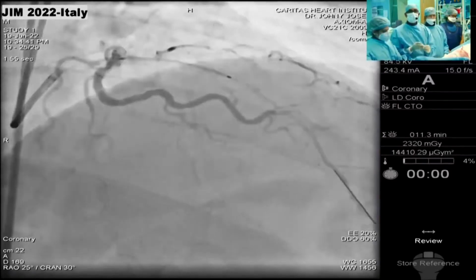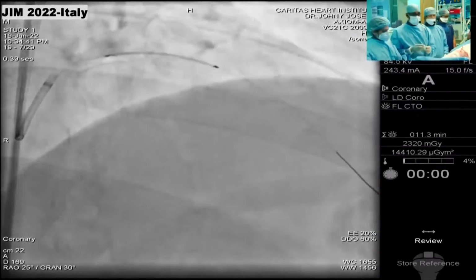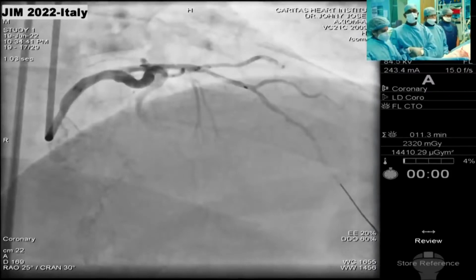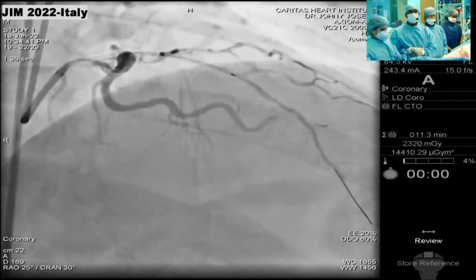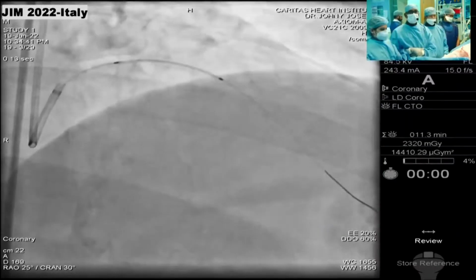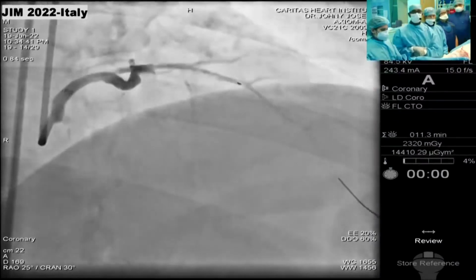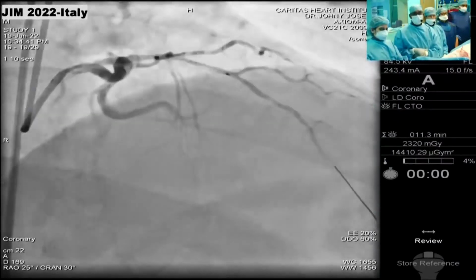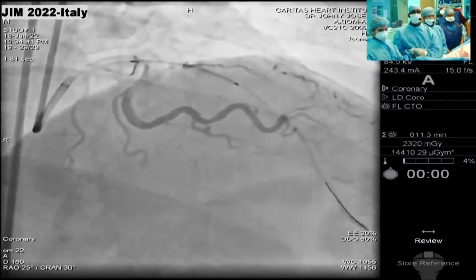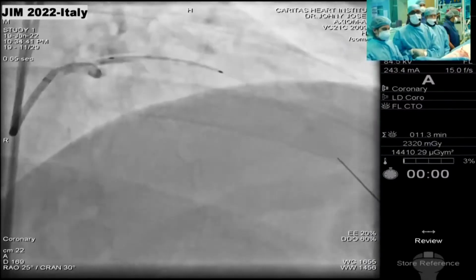I had the impression that the size at the occlusion of the vessel was a little underestimated; it is probably 3.5, at least in that elliptical area, in one of the two measurements of media to media diameter. Still, I think the choice of being a bit undersized with the stent to start distal, and using a larger 3.5 going from the proximal LAD into the left main, is very wise, and I've seen a wire protecting the circ, which is definitely the most important vessel to protect.